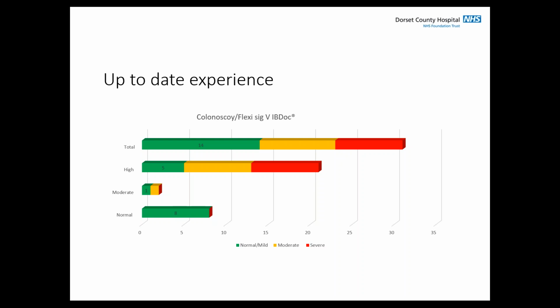We did have, unfortunately, a very exuberant healthcare professional in the team who liked to give out the tests two or three at a time, and we actually had some expiry. So that was a bit of a nightmare from a point of view of wastage. But actually, that's just 23 tests out of over 300 that we've carried out. So it's still a very low percentage overall. So that was reassuring to us.